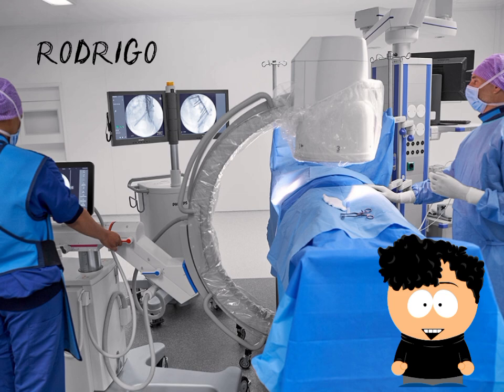Safety and protection. Radiological protection measures should be taken to minimize exposure to X-rays for both patient and medical personnel. Equipment maintenance: regular maintenance is necessary to ensure the equipment functions correctly and safely.